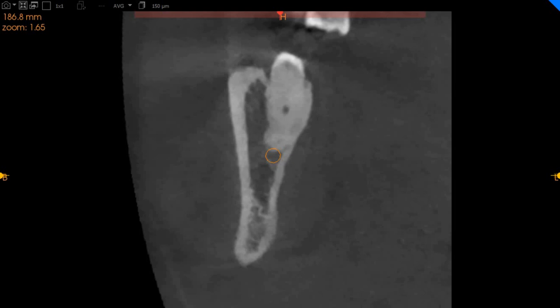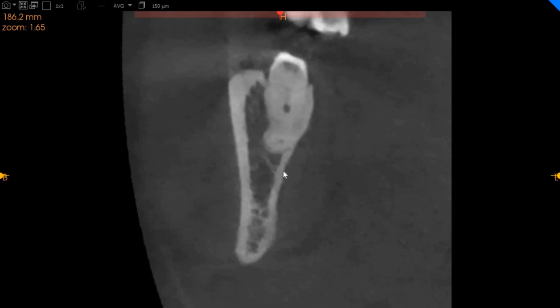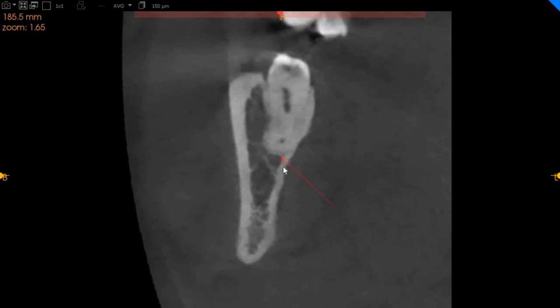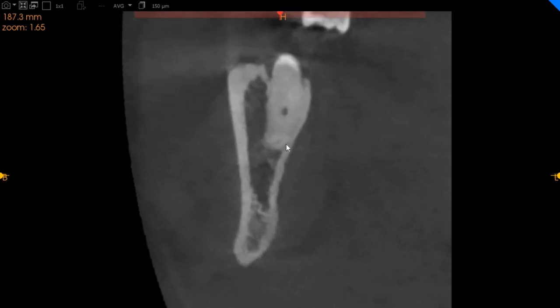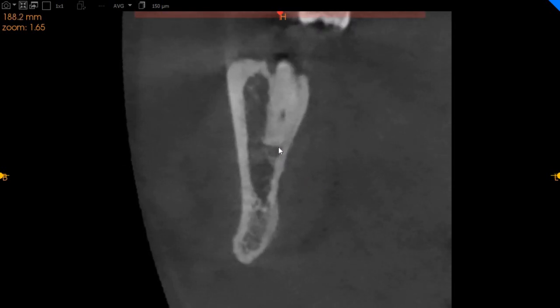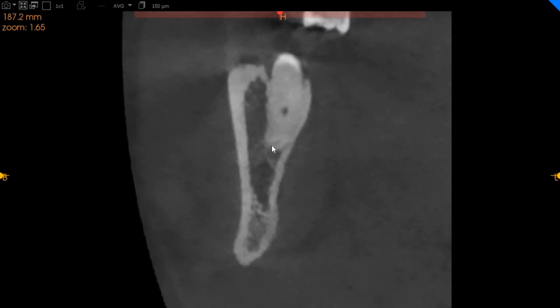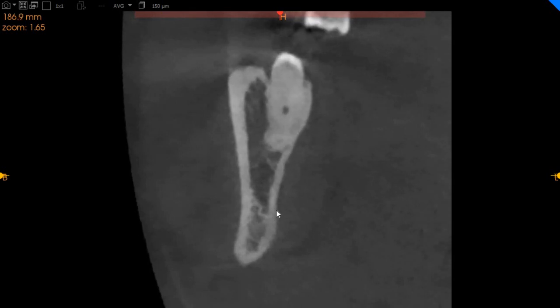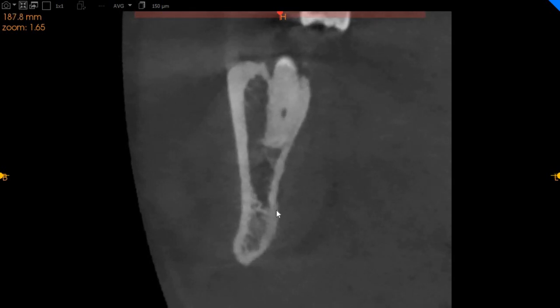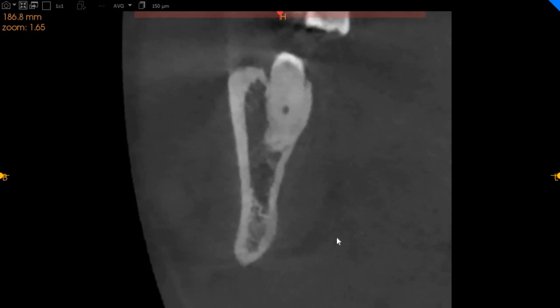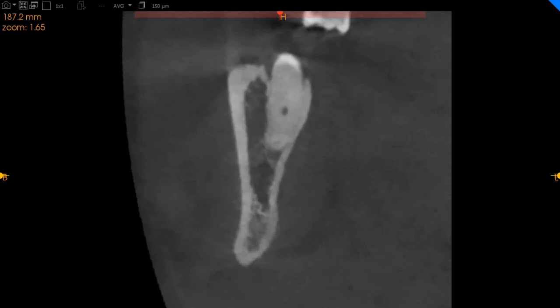If I remove the highlight at this point right here, you can see the canal gets compressed by the apex of the lower left wisdom tooth, and that is something to be kept in mind. So apical pressure should not be applied at any cost. This is something which is different from the right-hand side.